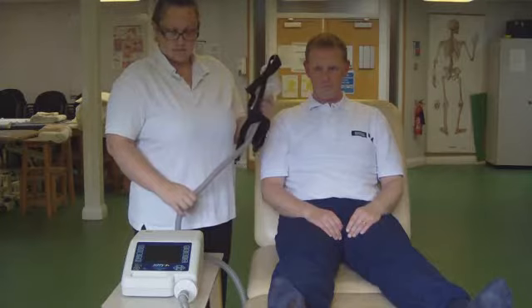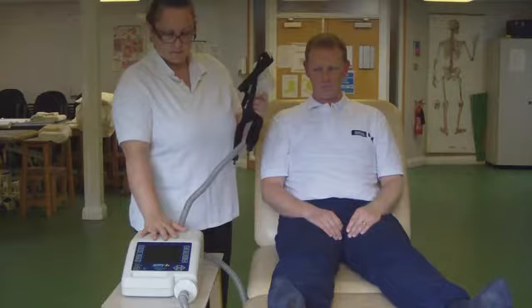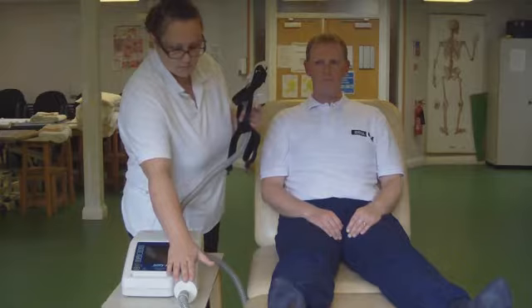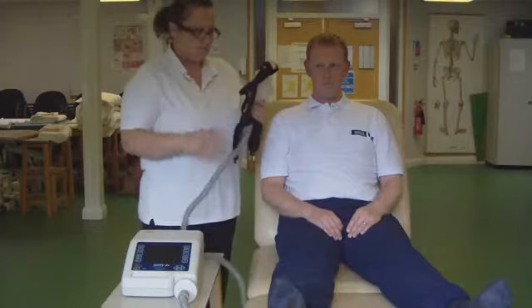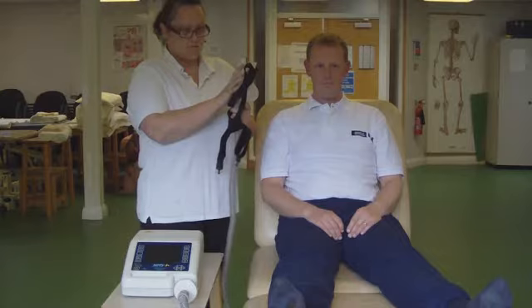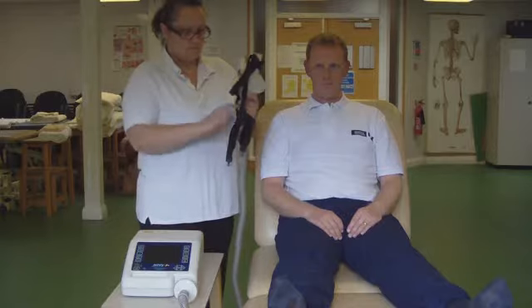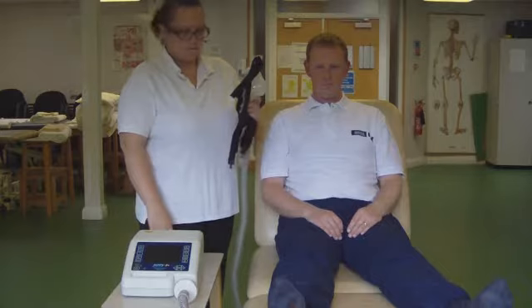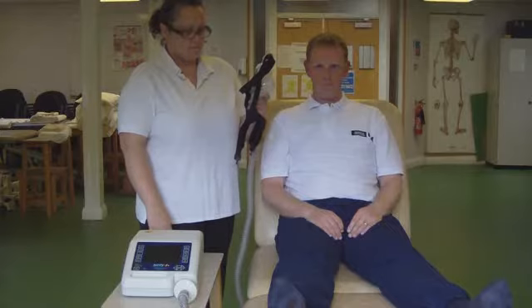So for this we need the machine to deliver whatever form of non-invasive ventilation we are using. We need a filter to ensure that the air going to the patient's chest has relevant particles and bugs filtered out, a length of elephant tubing, and a mask, either a face mask that goes over the nose and the mouth or a nasal mask that just goes over the nose. And both these sorts of masks have a head strap that actually fixes to the patient to secure the mask. Because it is positive pressure ventilation, it needs to have a secure fit around the patient's face.